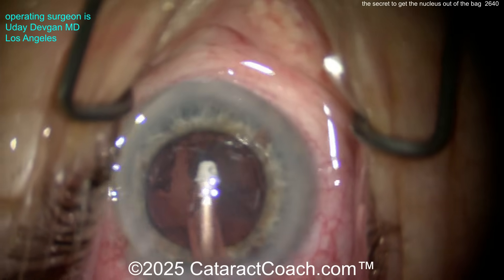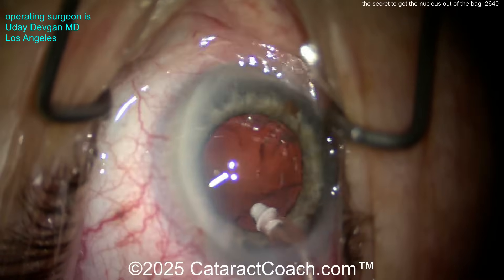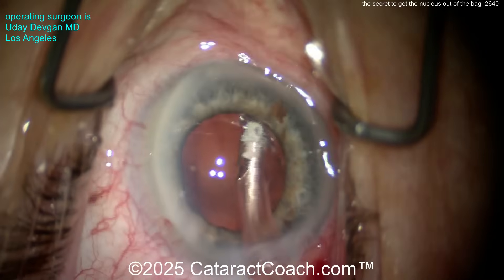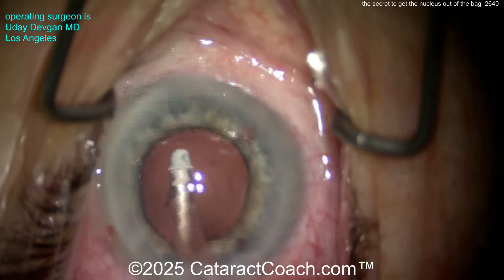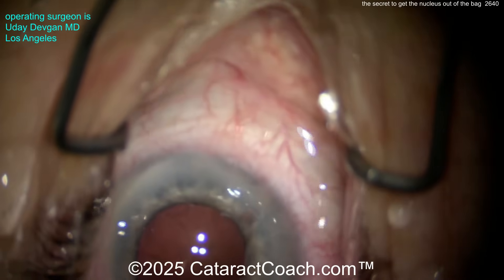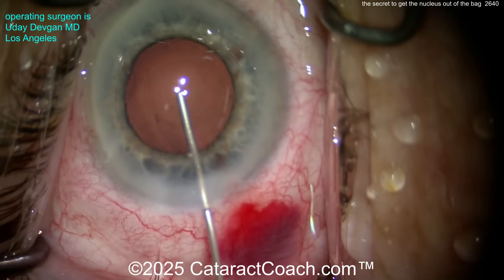Here comes the I/A probe and we'll clean up the cortex — do a nice thorough job here. The rest of this case is pretty normal. The patient has normal zonular support, no issues there, and it's otherwise a pretty healthy eye. Cortex is cleaned up pretty well — I'm happy with this.